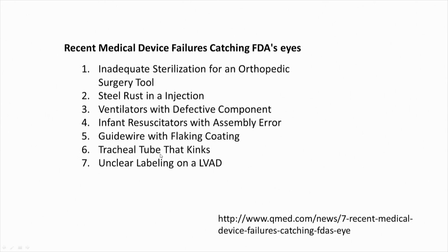Unclear labeling is another problem. If the label is not clear, it can lead to a surgeon making a mistake, either putting it in the wrong direction or using the wrong product. So, these are some device failures that the FDA has recently observed, and you can see them on this particular website. Again, it is very interesting to have a look at them.